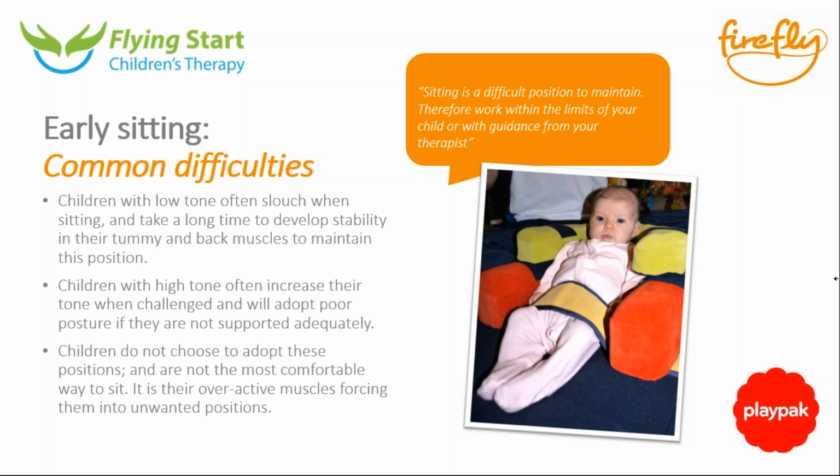It's important to note, though, that if a child does that and throws themselves backwards, it's not a choice to go into that position due to comfort or discomfort of the actual sitting. It's just that their body reacts that way, and it's not a chosen thing to do. So yeah, next slide, Claire.